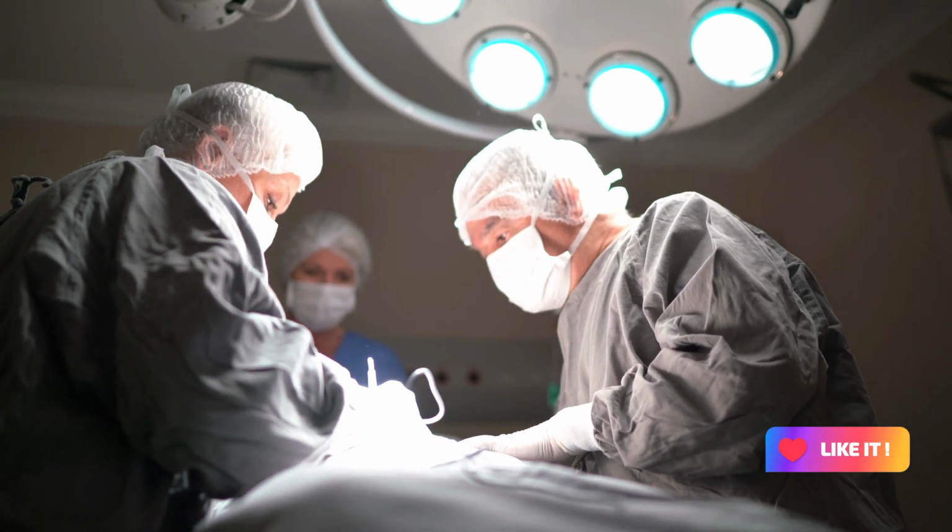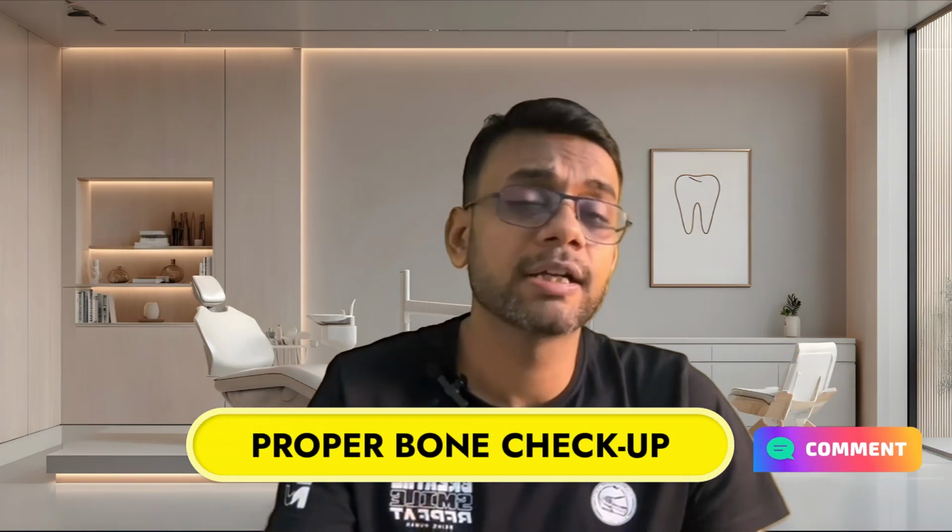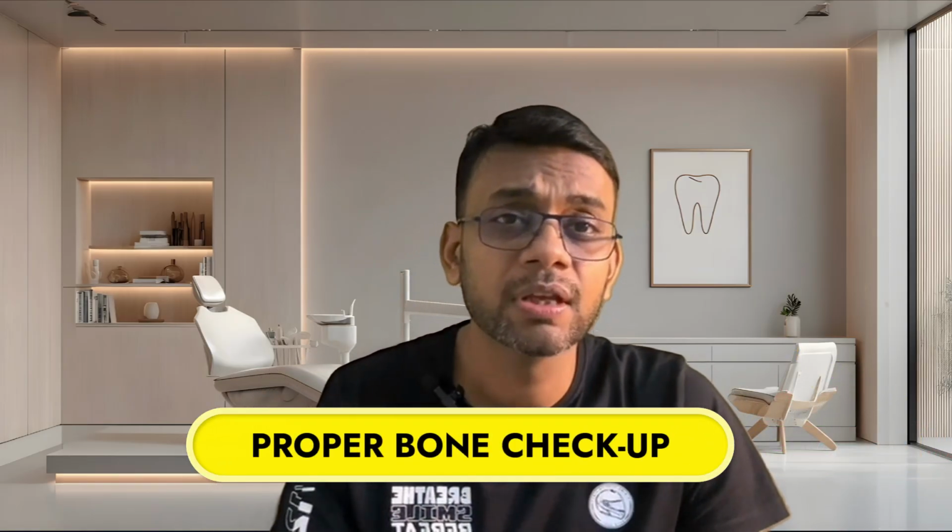We just do a clinical examination and we commit the patient. Mostly in the maxillary 6 regions. That is where we suffer a lot of difficulties, because when we see intraorally we see a wide ridge and we assume that there's going to be a good bone height, but when we do a CBCT or an OPG, we see that bone height is missing, totally missing. So be careful guys, be careful about that.